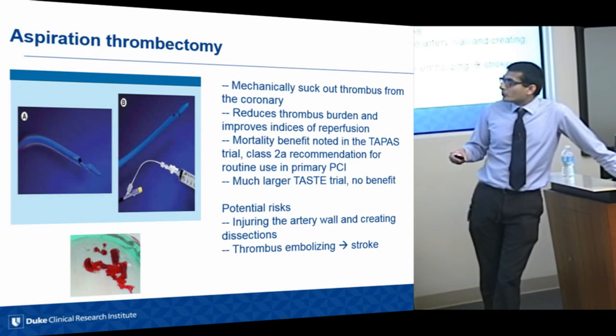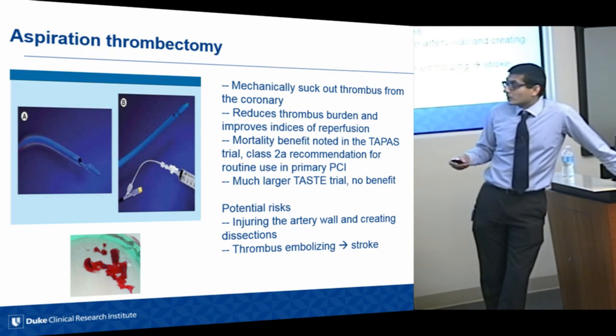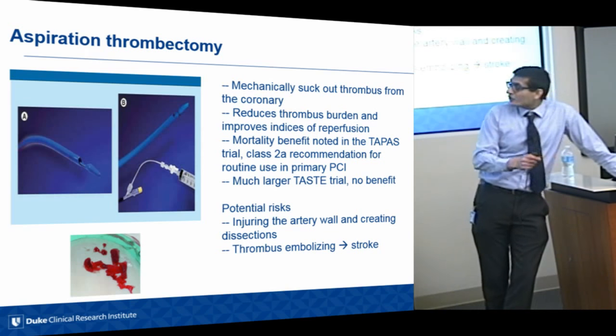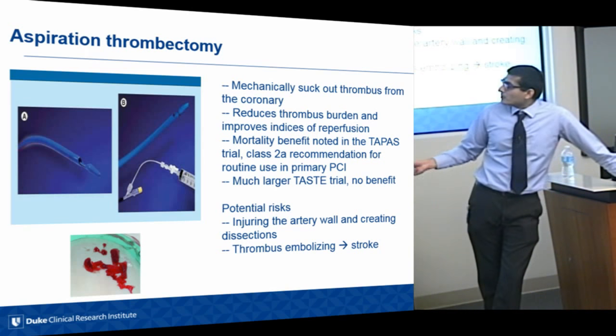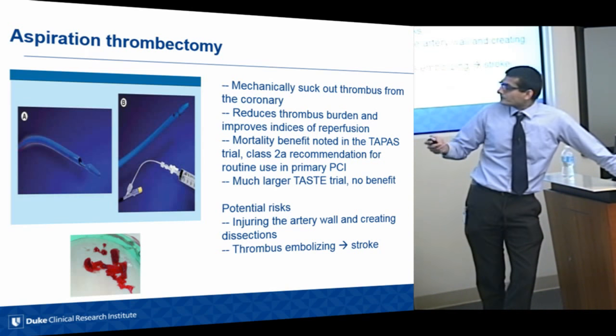However, a follow-up trial, the TASTE trial, did not find any benefit. In fact, they found that there were potential risks that when we put this thing down, we could injure the artery wall, we could induce tears within the artery, and we could potentially embolize this thrombus, which could result in stroke. So you could imagine thrombus sticking out here. When we remove this device out, thrombus could essentially fly off and give you a stroke.